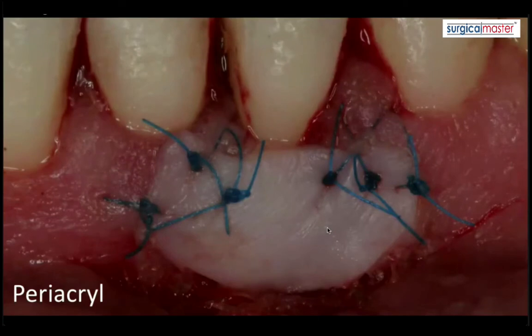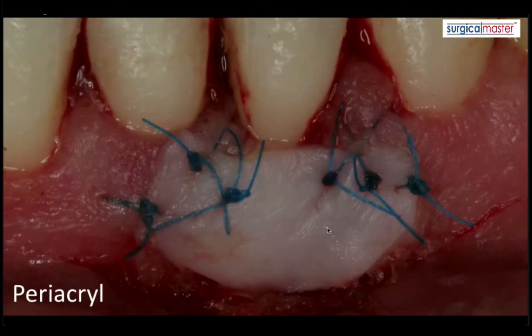You can see that the soft tissue graft looks almost frosted because it's glued in. Be careful with the Periacryl — if you put too much, you can have the patient's lip glued onto the graft or the teeth. So just a couple of little drops.